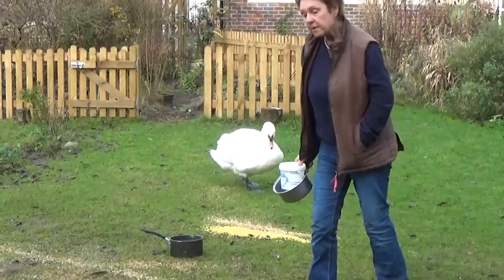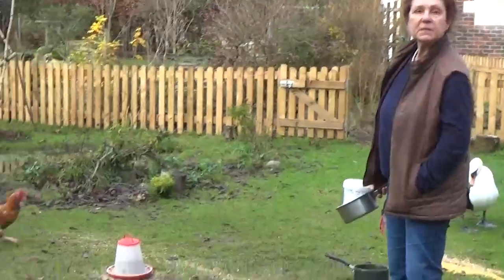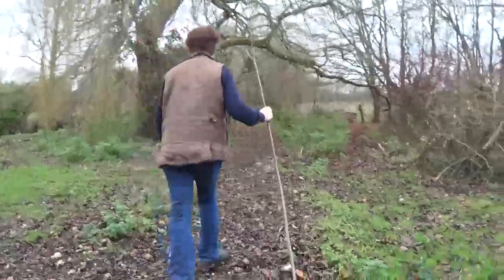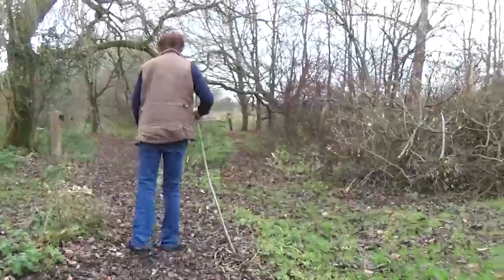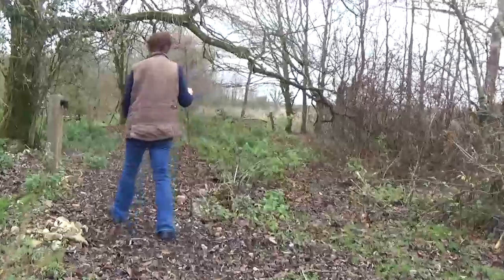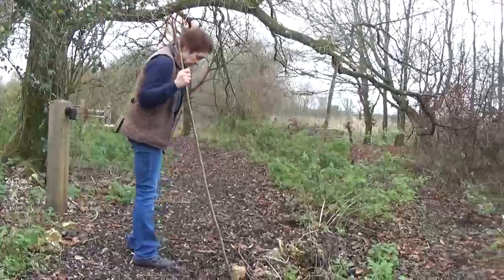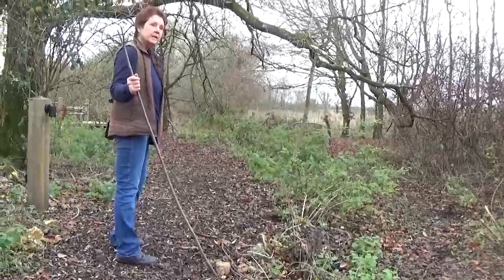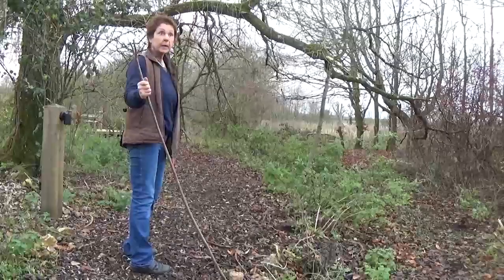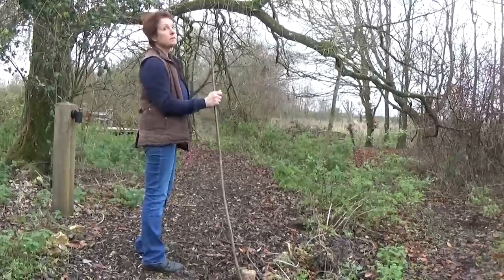We have five rescue hens as well and they like to muscle in whenever there's an opportunity. As you can see, the device is completely secure on my leg — it's not moving. The cuff is holding it well and comfortably. I'm not feeling anything and I'm not worried that it's been dislodged or that the wires are coming out.